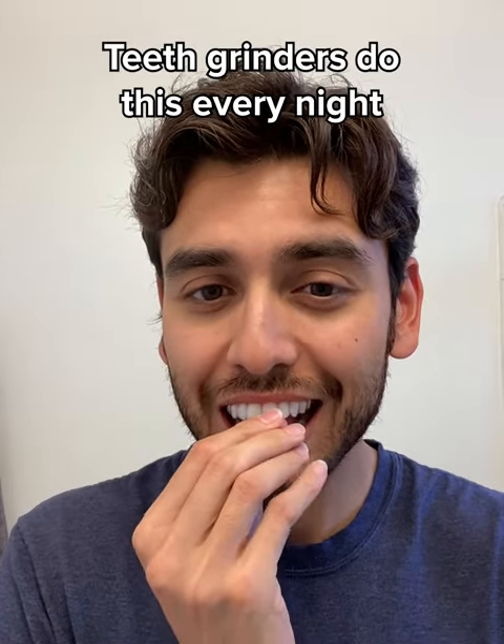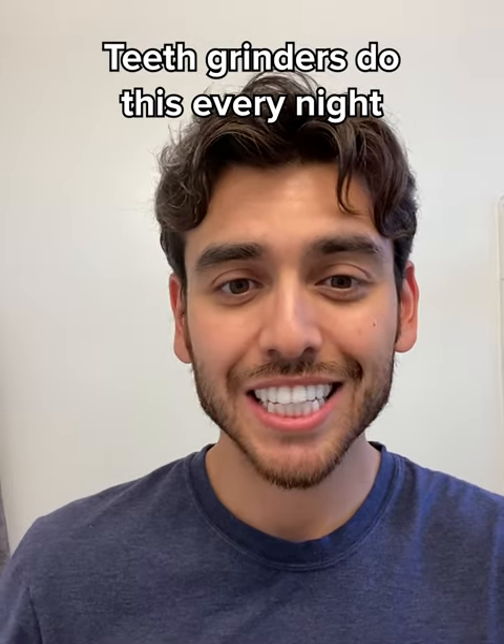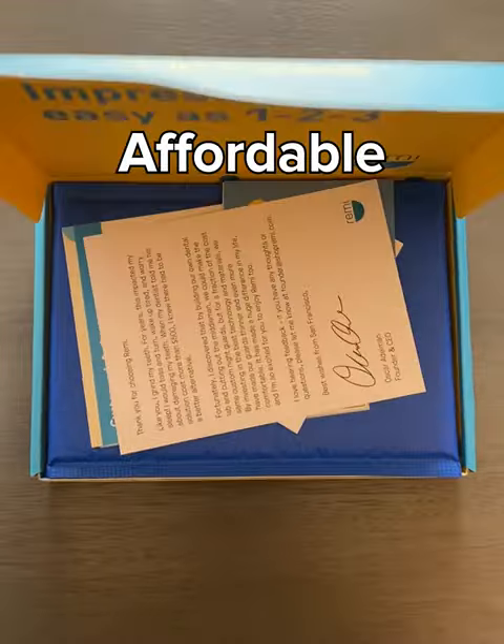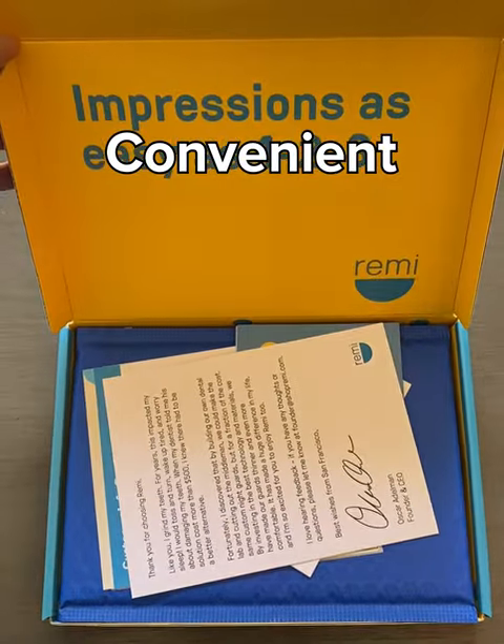An important part of my nightly routine is putting on my Remy night guards. I grew up grinding my teeth at night, but when I looked for solutions, most options were too costly and uncomfortable. Finally, there's Remy — an option that is affordable, comfortable, convenient, and durable.